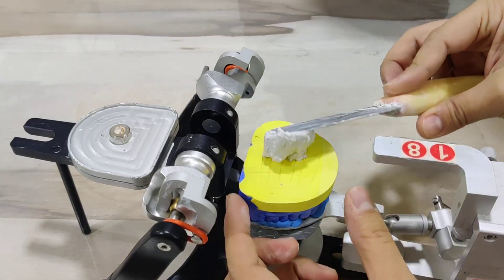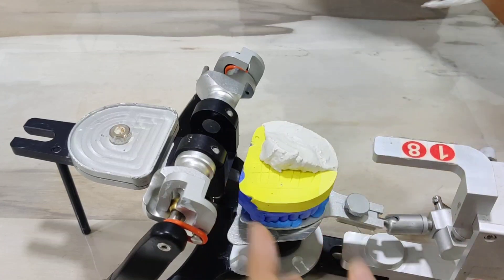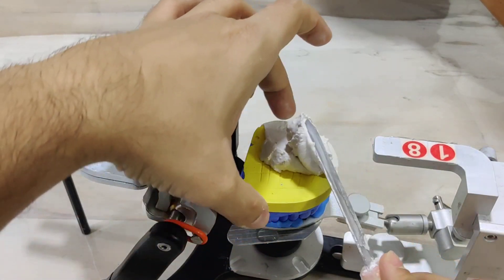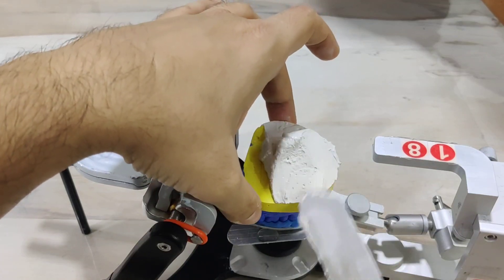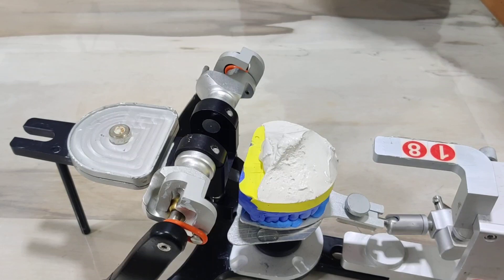We're supposed to seat this first onto the cast and adapt it onto all the margins, making sure that you do not leave any void in the center or towards the periphery.